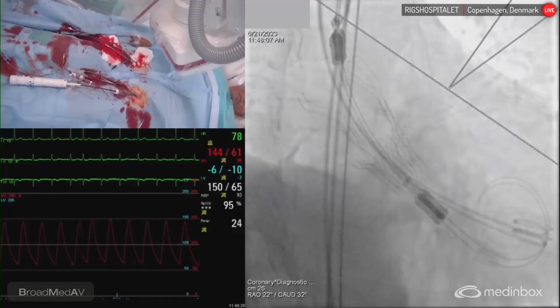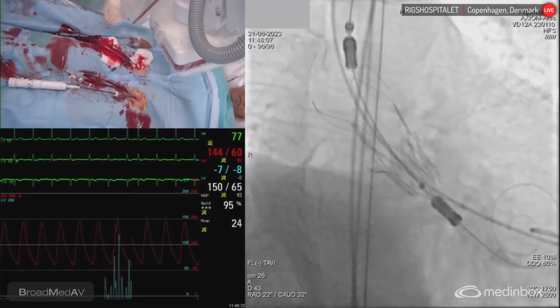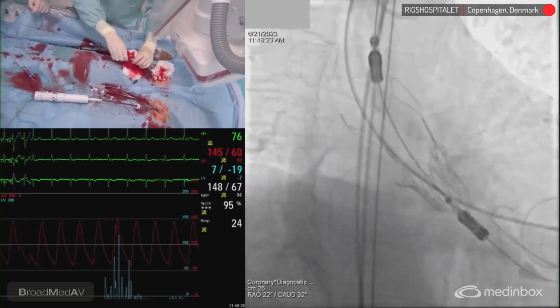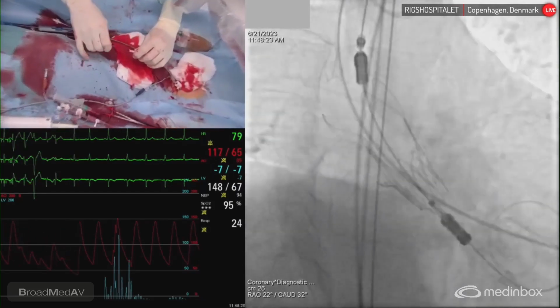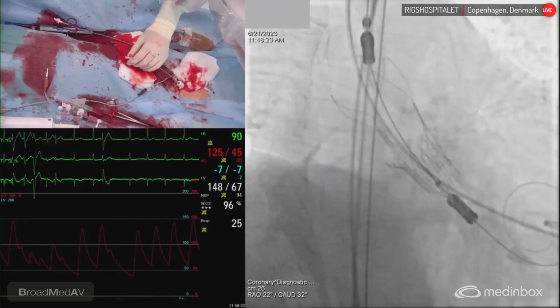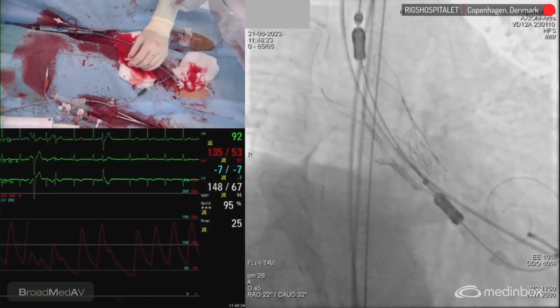And now we have to make sure that we're not on the outside of the frame, so I have to be able to push this. We have to be 100% sure. That's the point. Let's go with 7.5.